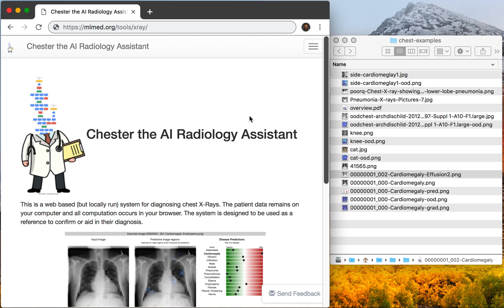What's unique about this system is that all processing occurs locally in the web browser, so no images are sent to us, and no computational cost is incurred by our group, allowing this system to be available free for anyone in the world — anyone that has a web browser, including smartphones — while at the same time preserving patient privacy because the images are never sent, so patient information stays on the machine that's doing the processing.